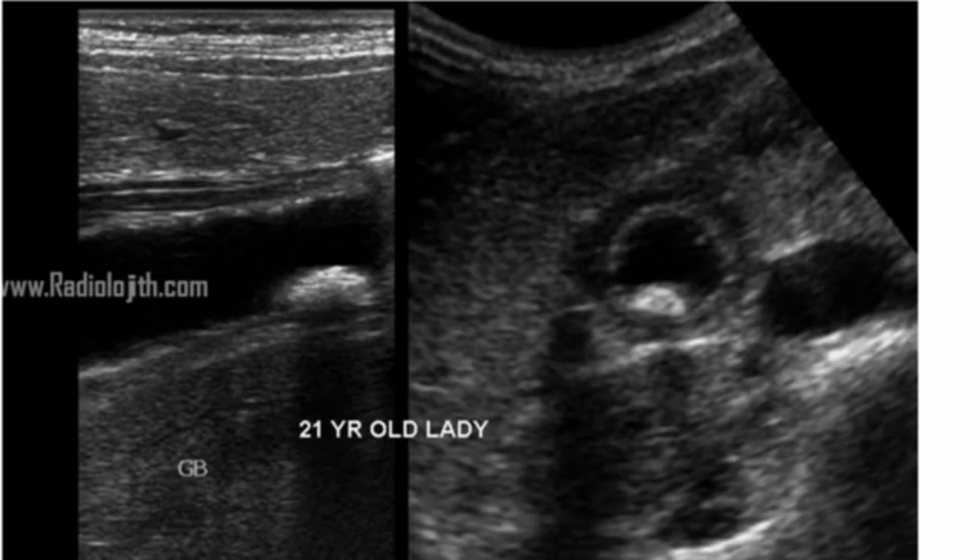Giving selected images of ultrasound abdomen focused in the right hypochondriac region to see the gallbladder in long and short axis, being tender on focused compression over the gallbladder. Rest of the abdomen appeared unremarkable.